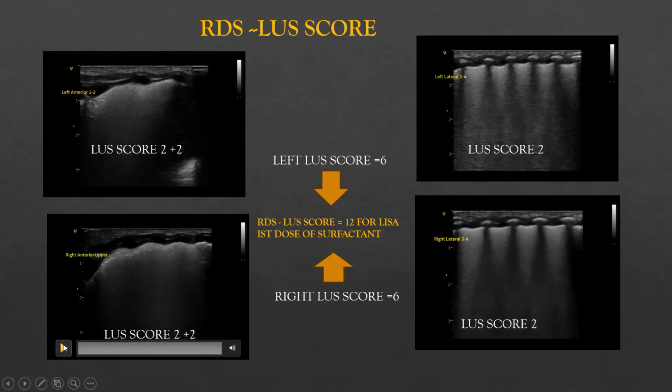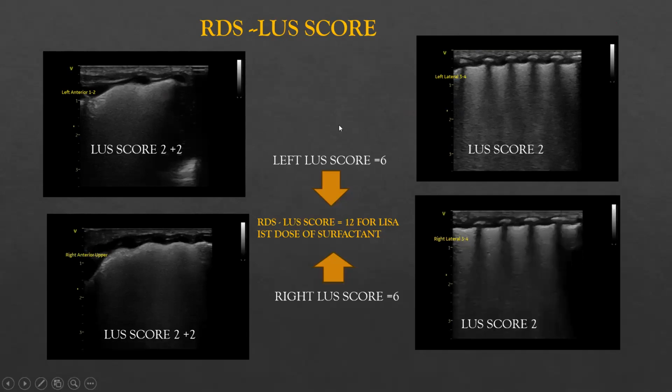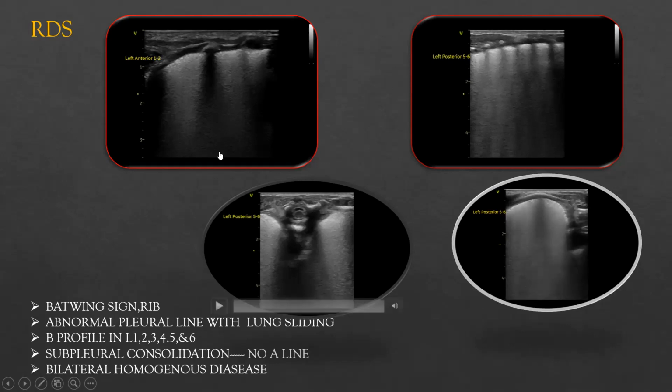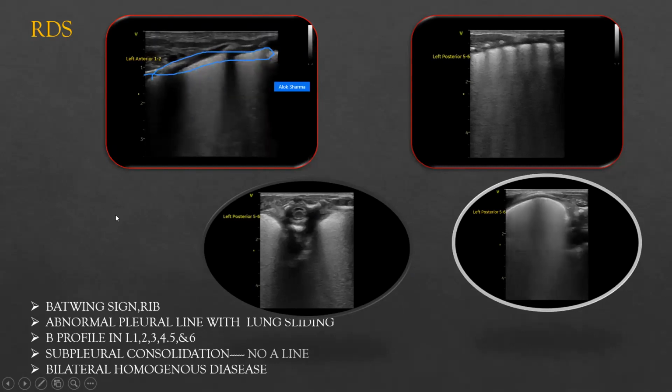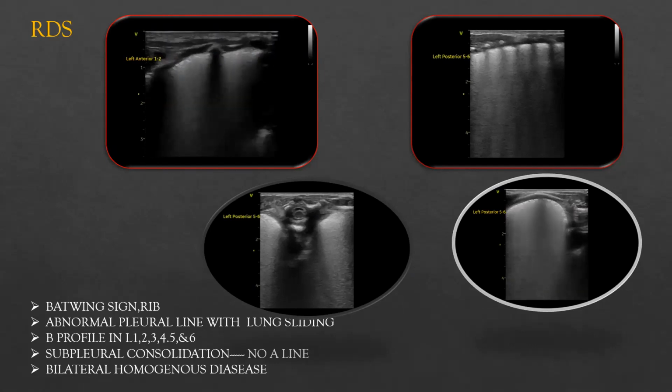If we just go to your previous slide, Dr. Ashraf, Satish had asked what the snowflake sign is. This one? No, the one before this. So it has a very mild snowflake appearance there, but it's actually this image here, this region. This is the classical snowflake sign for you. Very mild. You can see the snowflakes there, and this goes with the ground glass appearance. There are grades of snowflake sign that have been described by Pang et al. in their article. Again, something that I will cover with you on Sunday, where we'll talk about the severity of RDS and how we classify that on lung ultrasound. But this is a mild snowflake sign, and it would not be unusual for us to see a ground glass appearance on chest X-ray with this.